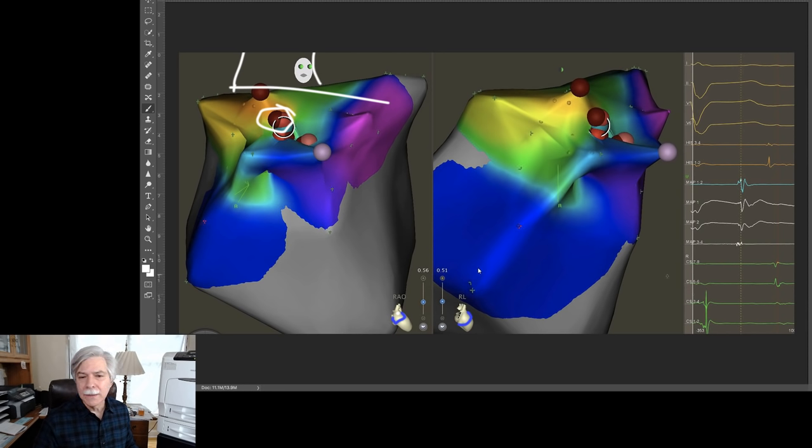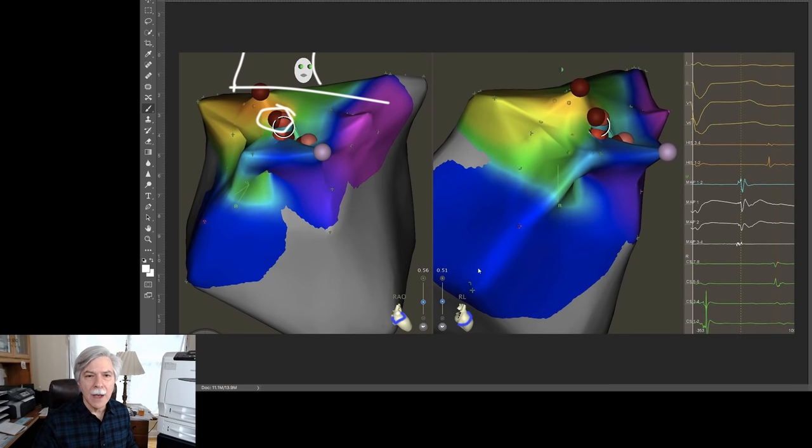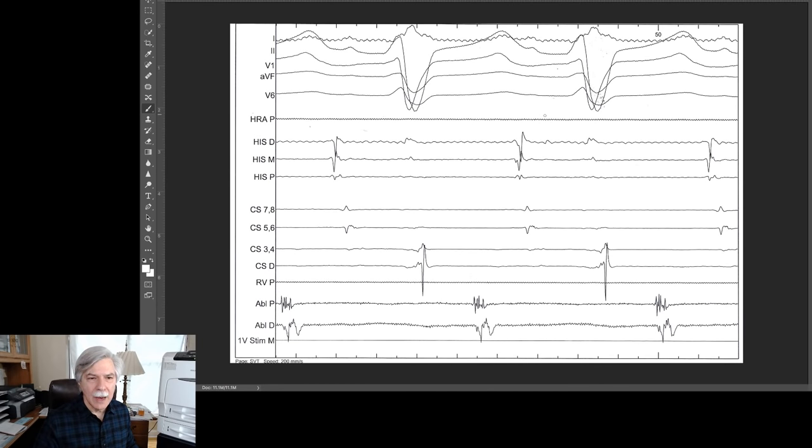And what we did was look at the electrical signal coming from that area. So here's a little bit better look at the electrical signal coming from that area. This is during the tachycardia. It was a little bit slow at this point because she was sedated. But you have this double bump P wave superimposed on the T wave. Here is the His region, and here is the coronary sinus. And those are all relatively late because the beginning of the P wave is over here.